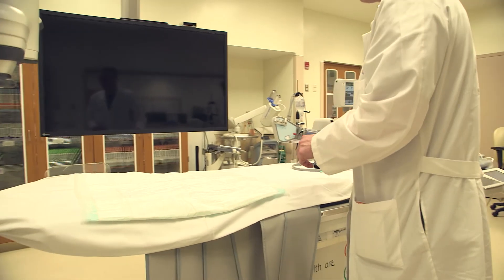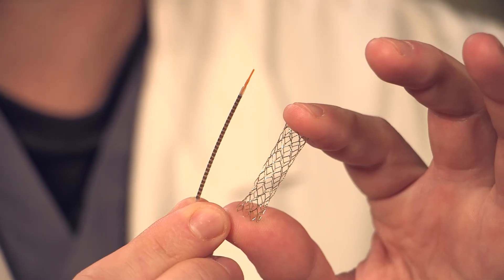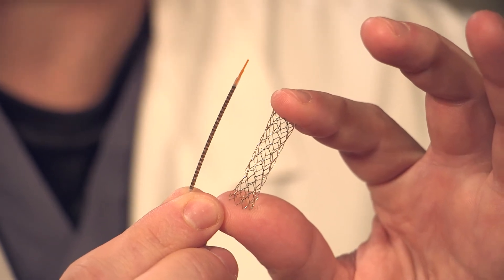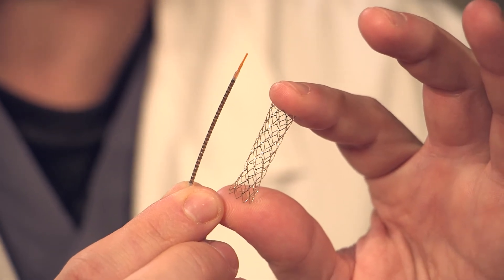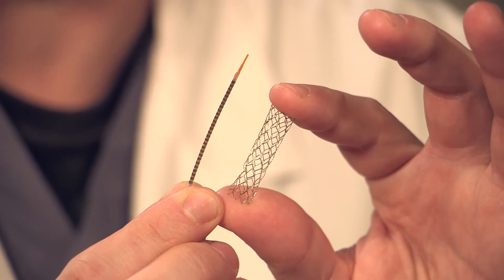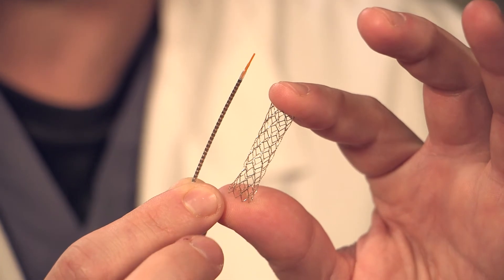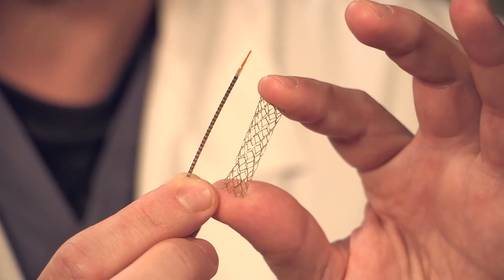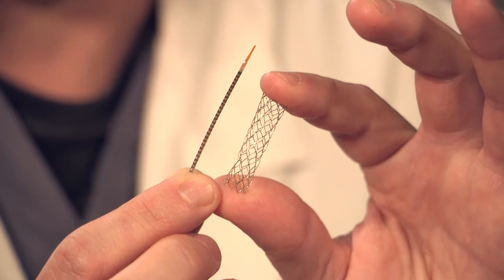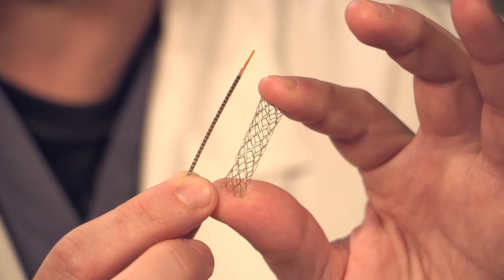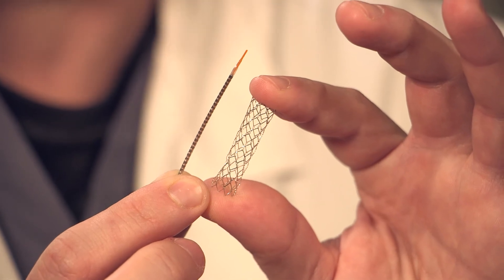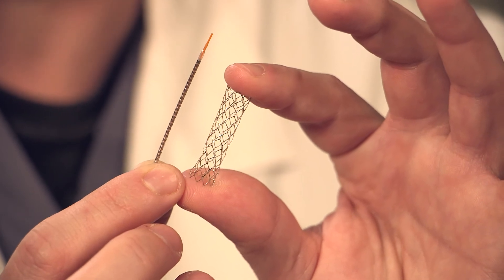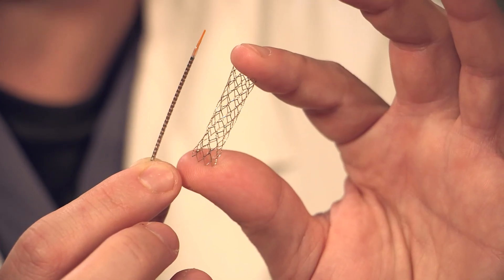Once we figure out where the blockage is, we want to treat it immediately. The way that we do that is we pass an undeployed stent through. On the left you'll see what it looks like before we implant it into the blocked artery. It is a metal device on an uninflated balloon platform. Once we get it to the position that we want, we inflate a balloon inside the stent to expand it into a cylinder. Once we take the balloon out after it's been inflated, on the right you'll see what the stent looks like after it's been deployed.